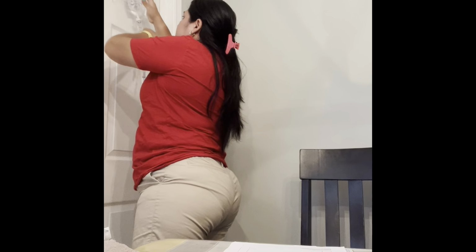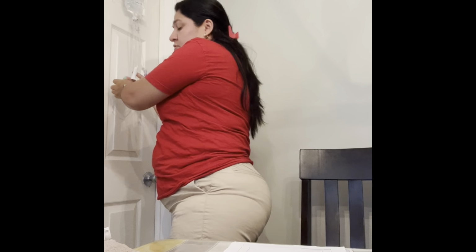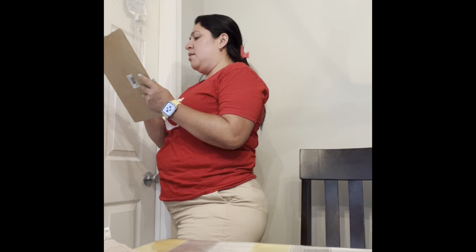I have it right here, and I'm going to do my second check. Sodium chloride, 500 ml to be administered continuously over 4 hours via gravity, 15 drops. Using my math, I have 31 drops. Sodium chloride, 500 ml. Now I am going to come back and wash my hands again. I'm going to do my second medication preparation.